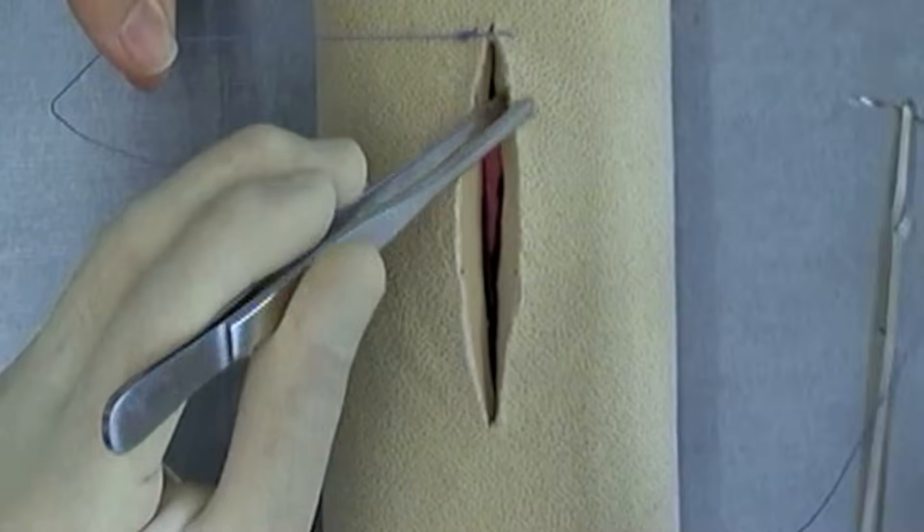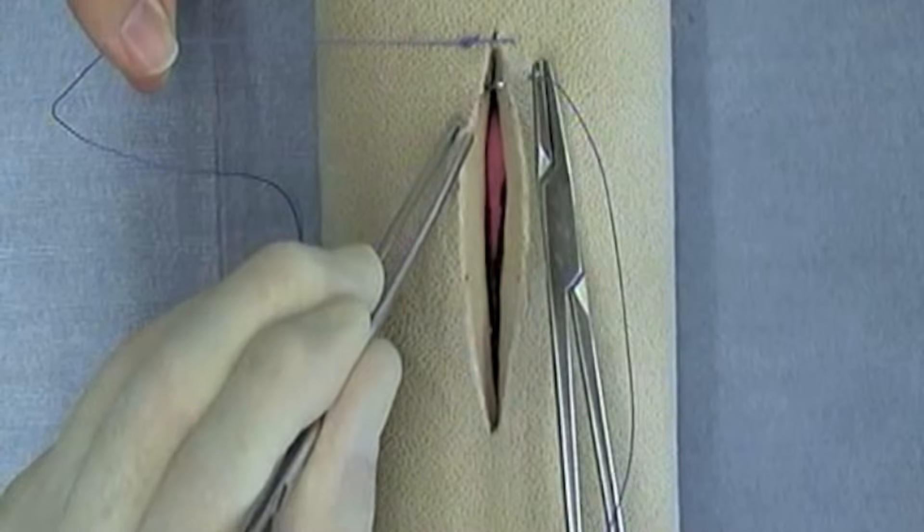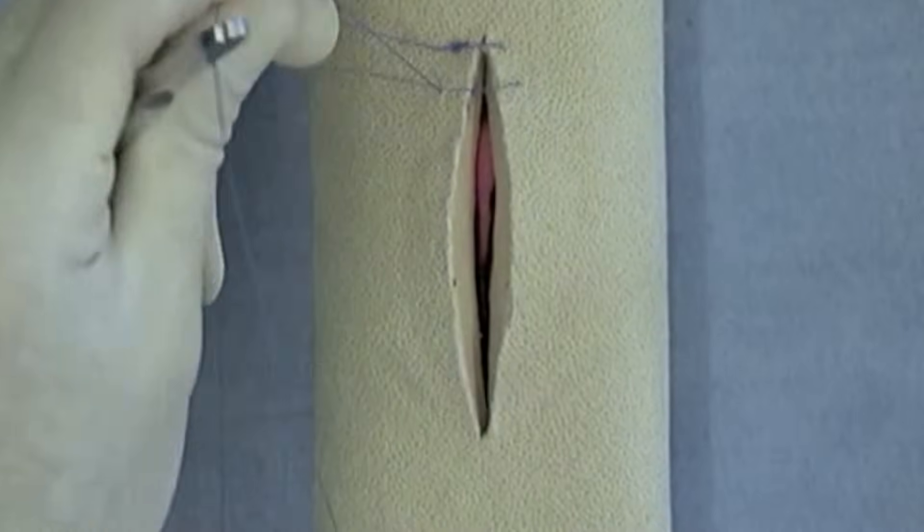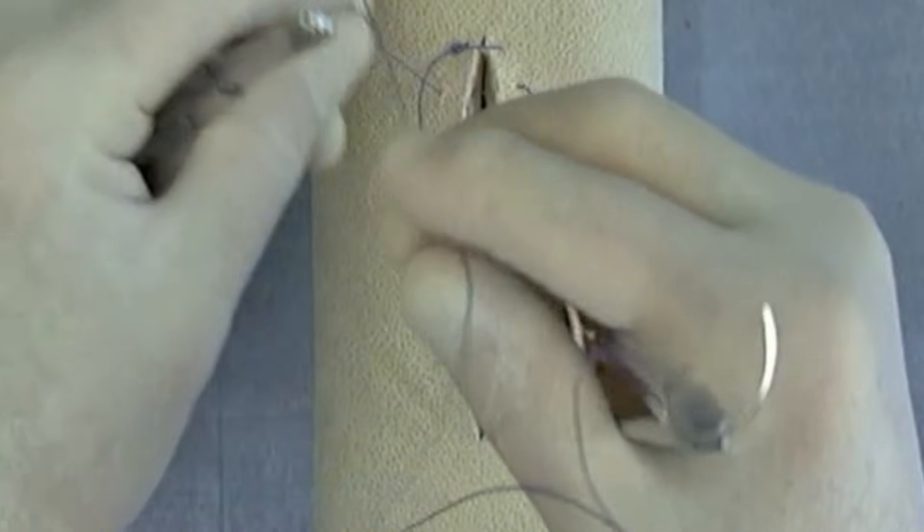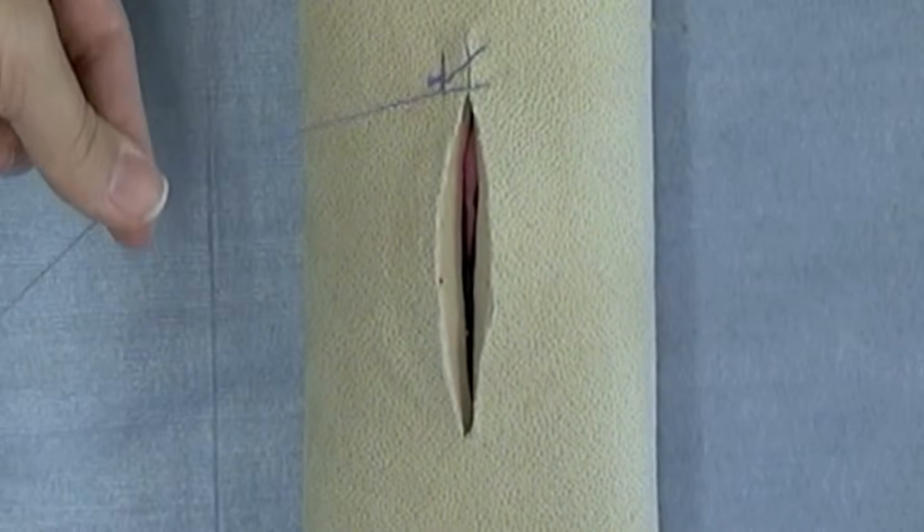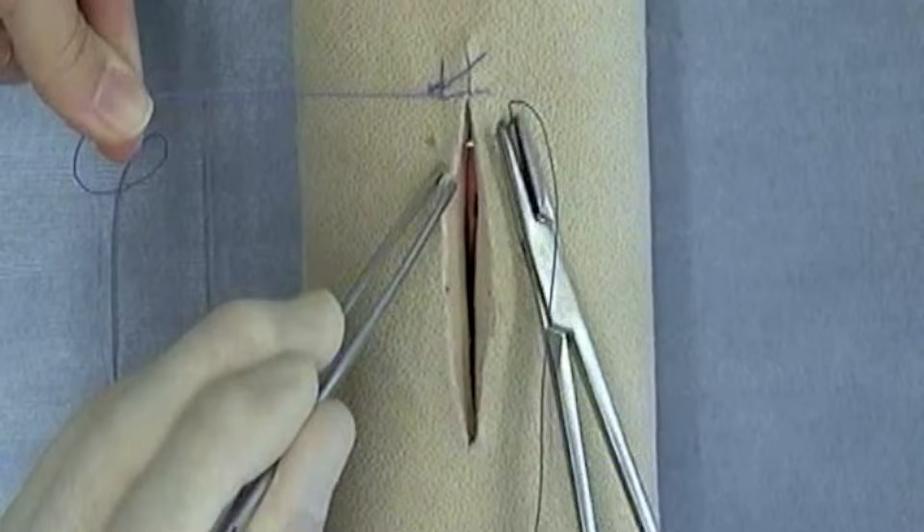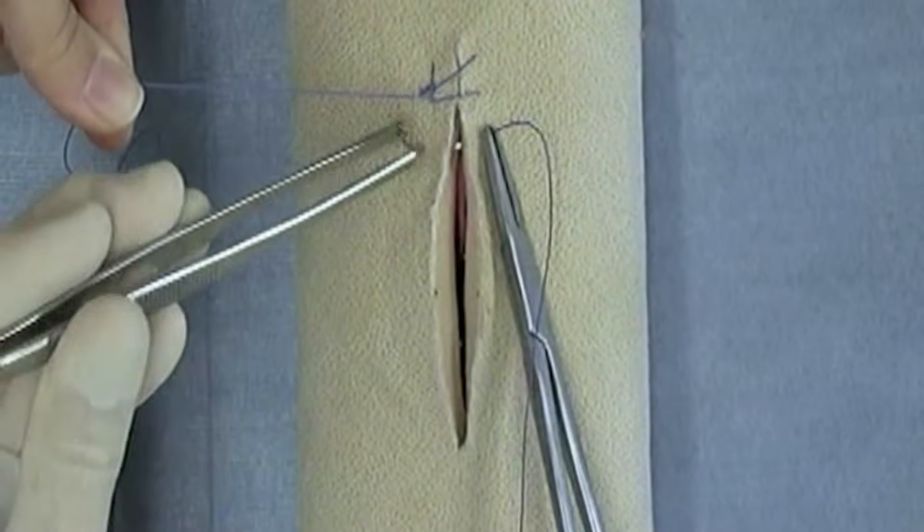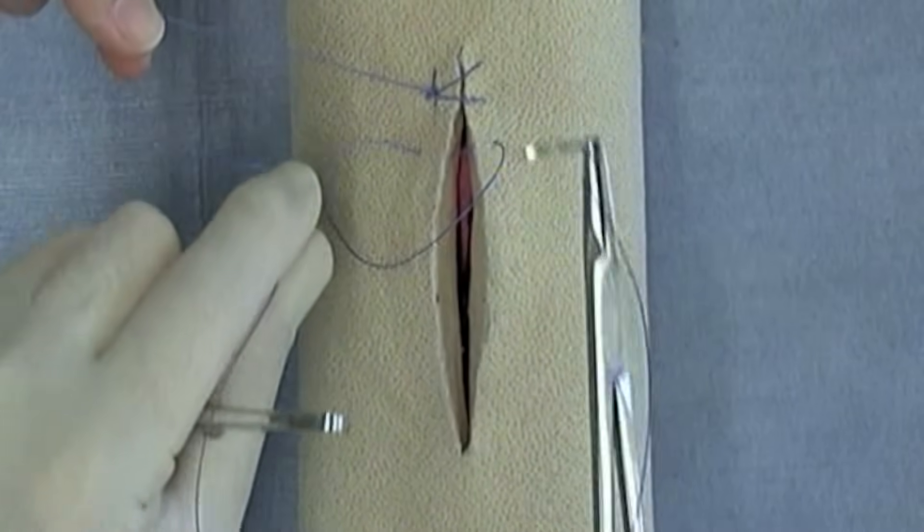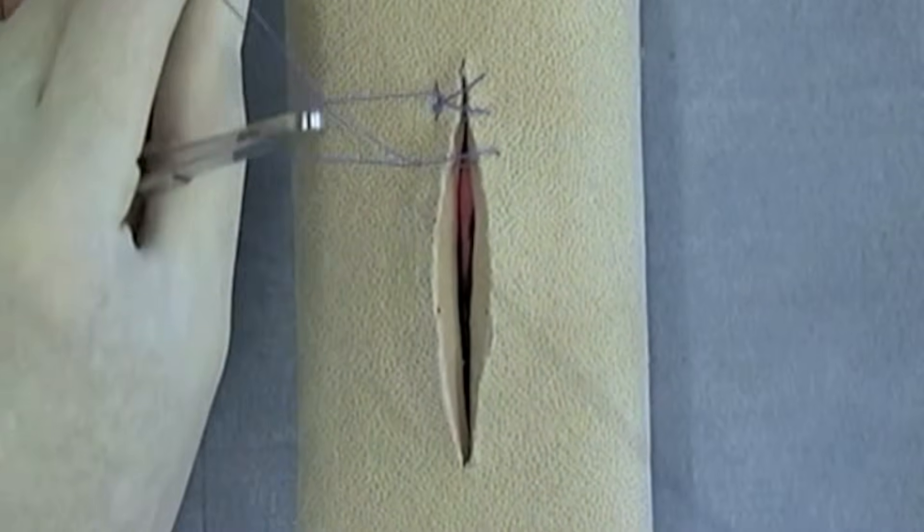And so now the pattern is done by continuously performing simple interrupted bites. But you can see I'm coming inside the loop of my suture, so as that's pulled down you can see now that there's going to be very even distribution of tension on the suture line. Once again notice that each bite comes inside the loop of suture being held by my surgical assistant.